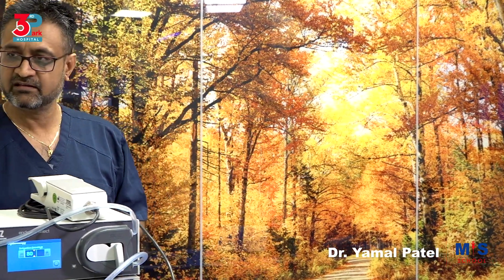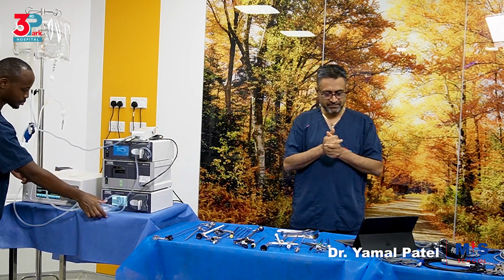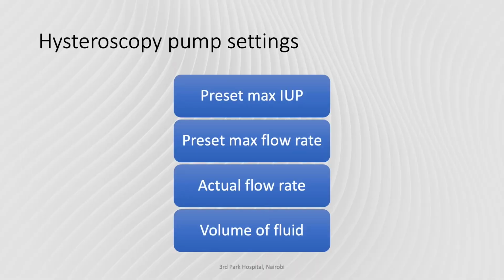So, in hysteroscopy pump, back to this, we are now going into the settings. The pump settings are the preset maximum intrauterine pressure, the preset maximum flow rate, the actual flow rate, and the volume of fluid. So those are the 4 parameters we would be monitoring.